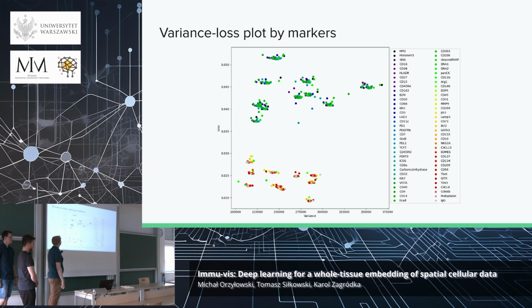So we get this plot, which is quite interesting. The color represents a channel, but each channel was fed in 10. Like each sample had all the... There were like 10 samples, and each had all the channels. And we can see that there is clustering by the batch, so points that are close to each other are coming from the same batches.